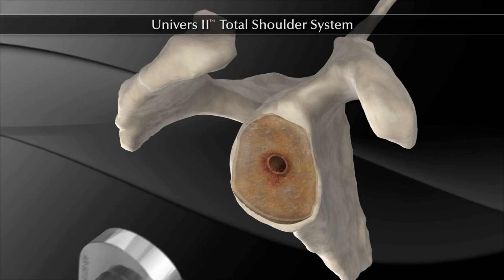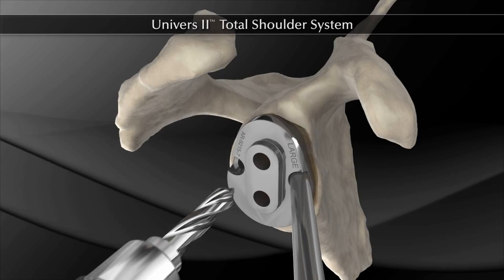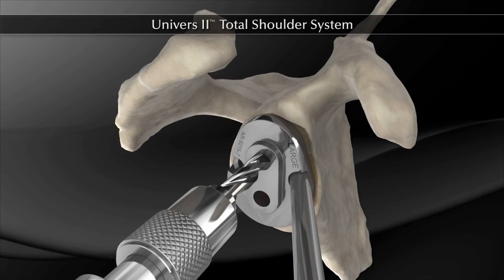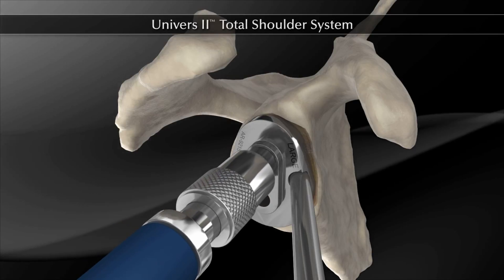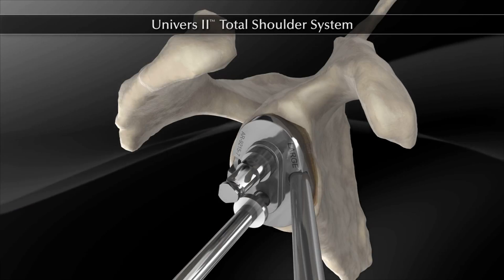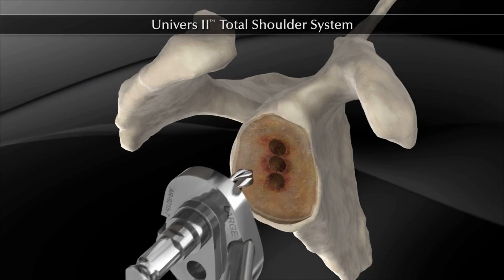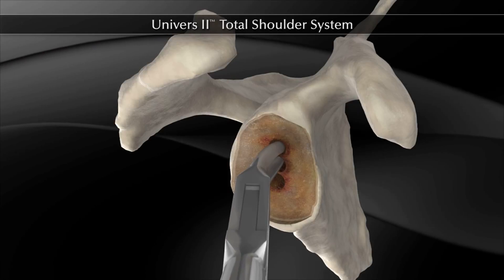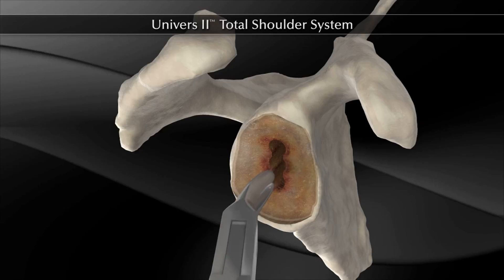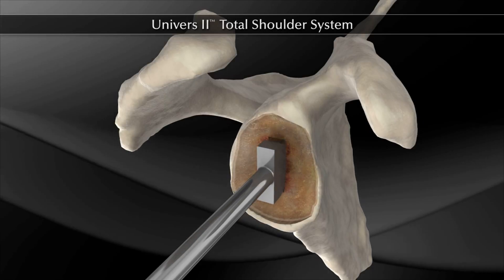The two-hole glenoid guide is moved into position by engaging the posterior peg into the previously drilled peg hole in the glenoid. The short drill bit is positioned into the quick-connect adapter and the superior glenoid hole is drilled. The drill bit is detached and left in place. A second drill is used to drill the inferior glenoid hole and the guide is removed. A small rongeur is used to remove the bone bridge between the three drill holes.